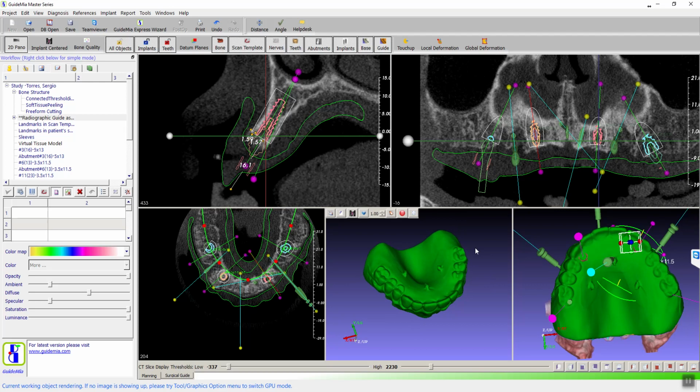At this point, your patient's already had the CT scan. If you want to change the geometry of the actual denture or duplicate denture, you're going to have to call them back in for another scan because there's no way to match the fiducial markers. The reason I'm asking is because sometimes the duplicate denture doesn't go all the way to the depth of the vestibule, which in turn makes it short for the guide pin. We'll ask for the impression to go all the way up the vestibule, but most of the time, they still won't do it. They'll just take whatever denture's there with a short flange and do it.